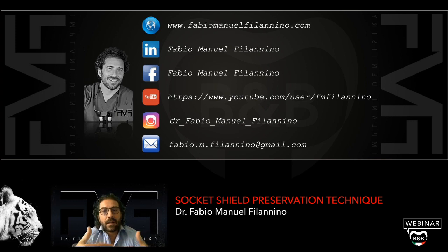But still, we can learn how to do it gradually. And my suggestion is to start from an extraction where, for example, we have to keep a pontic area, and not in an aesthetic area at the beginning. So with this, we can start to practice with minimum risk, because if something goes wrong, you can go through a normal socket preservation with the biomaterial and membranes, like we all do every time.